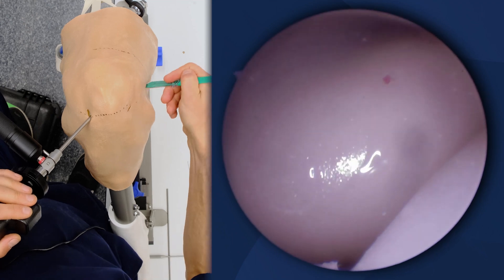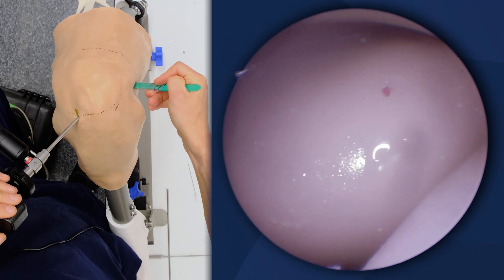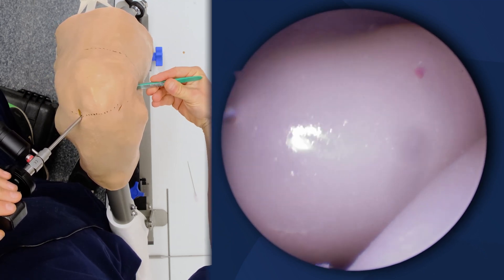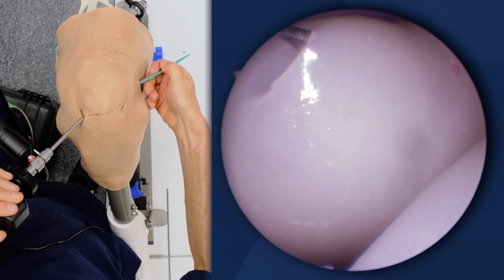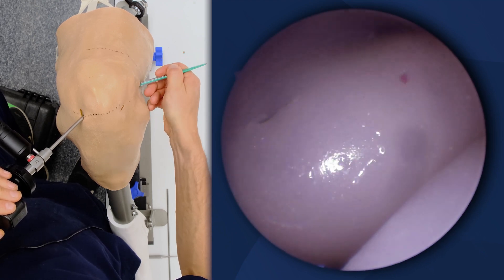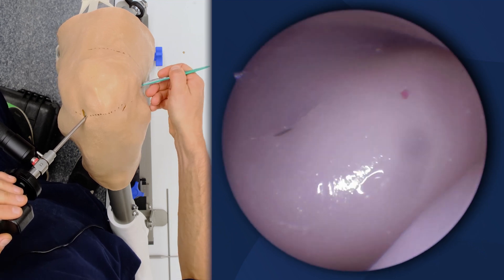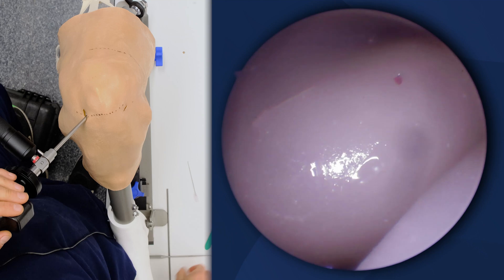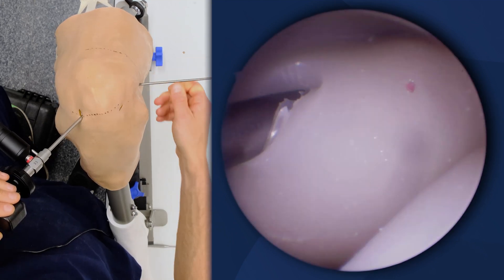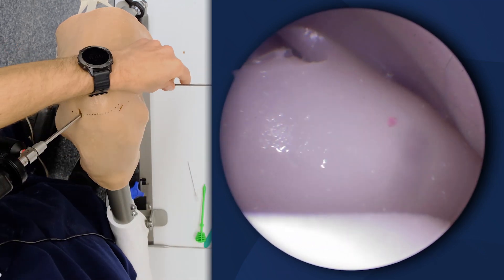I'll take this needle out. I'm going to come in with my blade. Generally I like to cut obliquely in the direction of the posterior oblique ligament. I like to enter with my trocar and then slide my cannula over top.